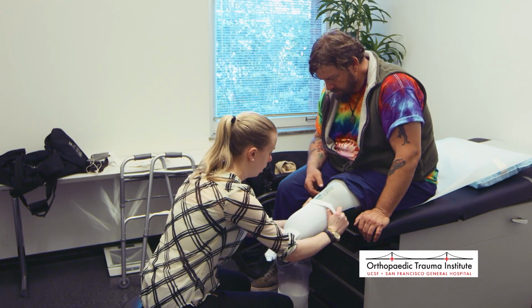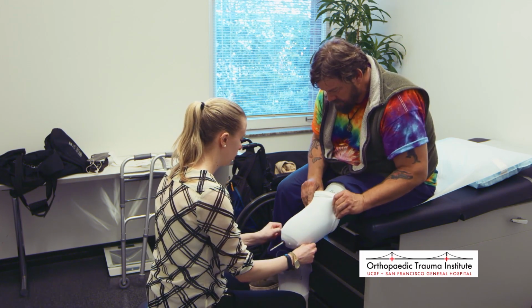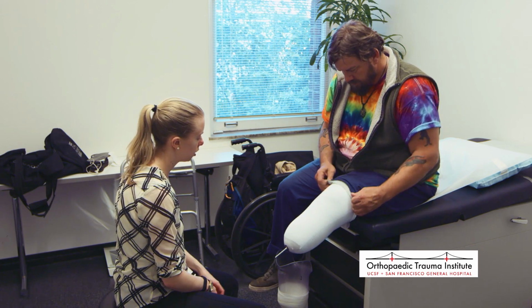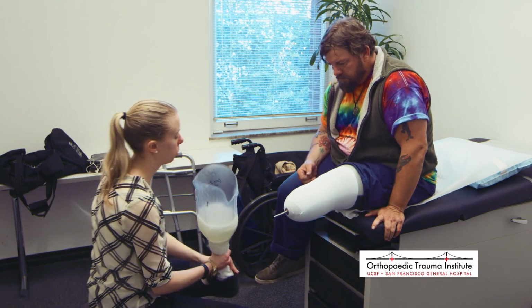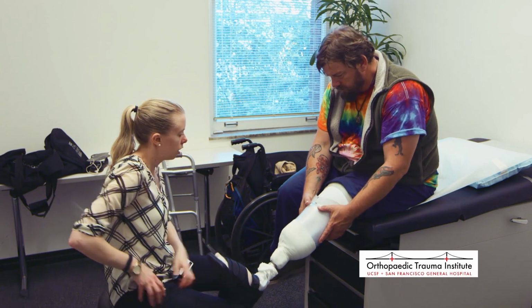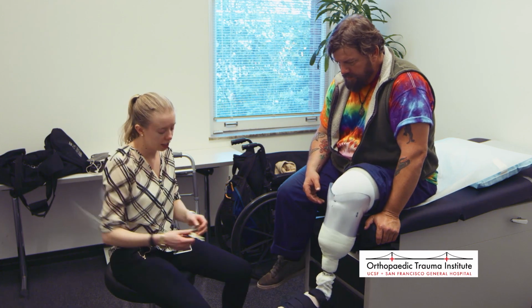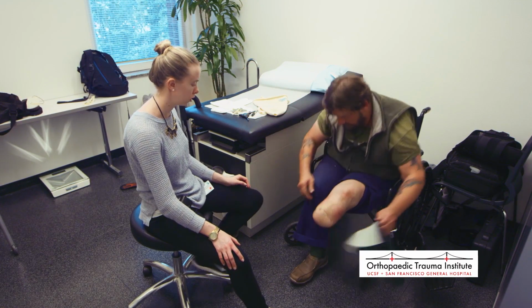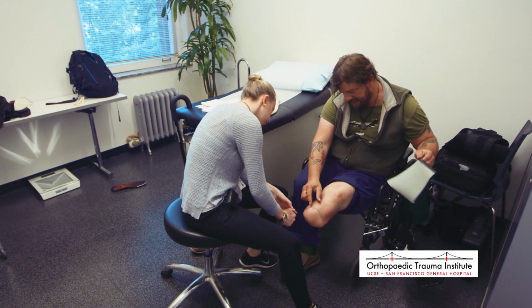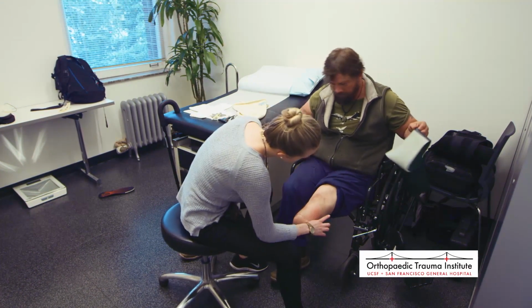So then I added a series of socks, a 5-ply, a 4-ply, and a 2-ply, and educated him about sock ply management. We talked about the Goldilocks Principle, which is our sock ply management explanation. Having a well-fitting socket requires daily sock ply management from the user. If the socket is too loose, then pain at the bottom of the limb will become common and can cause skin breakdown. If the socket is too tight, then numbness and tingling can cause the wearer to feel the need to remove the prosthesis to relieve the pressure. The ideal fit is somewhere in between, not too loose and not too tight. This is referred to as the Goldilocks Principle.